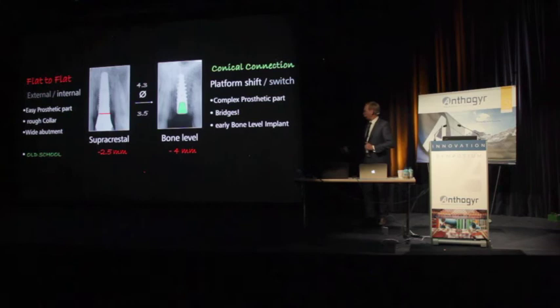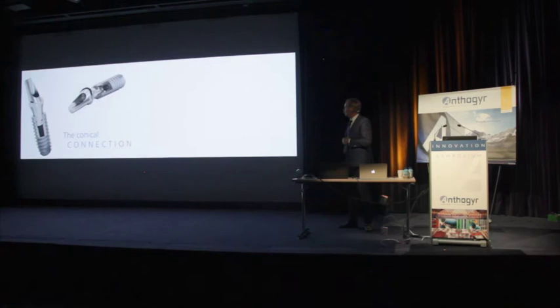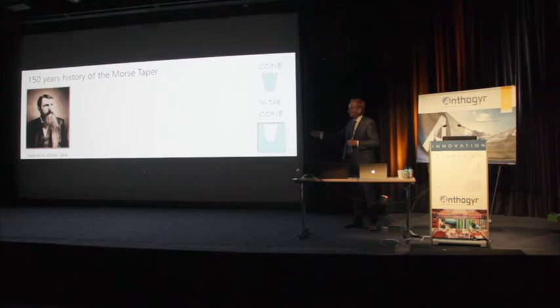So I go from the old school to the most common design with a conical connection, and we call it a bone level implant, because also the Straumann company reintroduced this word in the industry. So let's have a closer look at the conical connections. Are they all the same? We have history, we have literature, and I went into it, I studied it.